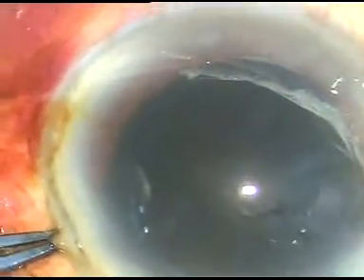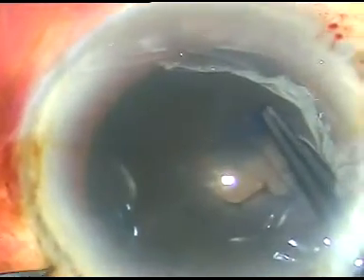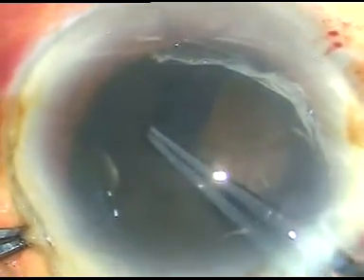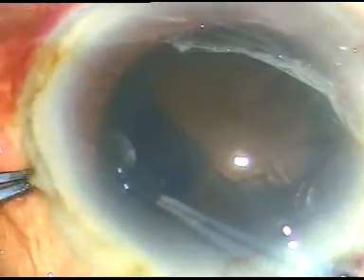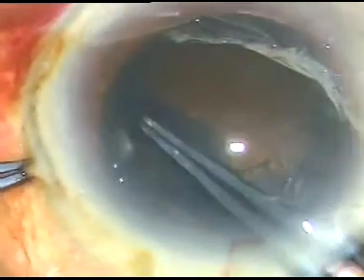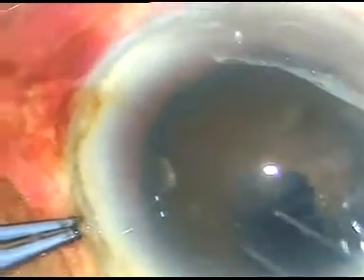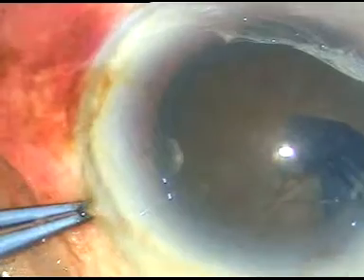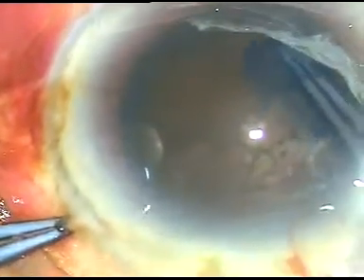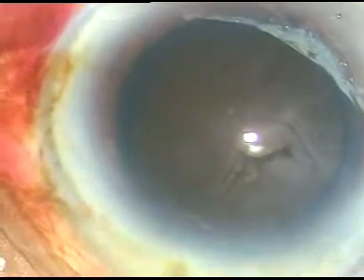Number 1: we should stain the capsule with trypan blue dye so that we can see the capsulorhexis margin all the time, because contrast is very less in this kind of cataract. Unless we stain the capsule, we will not be able to see the capsulorhexis margin. And if we damage the capsulorhexis margin while chopping this kind of cataracts, we may have great problems. So the capsule should be stained with trypan blue dye.